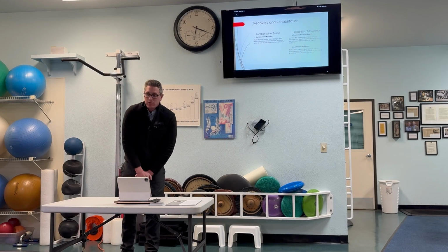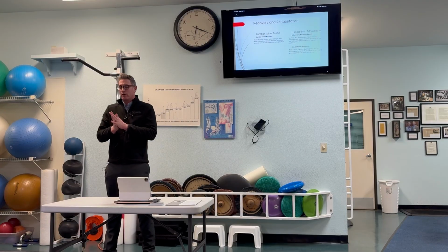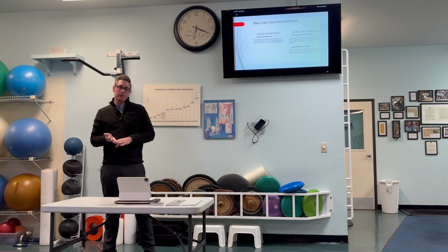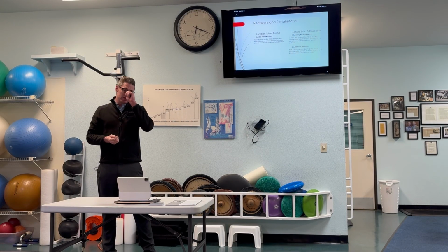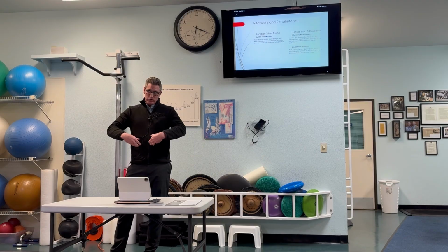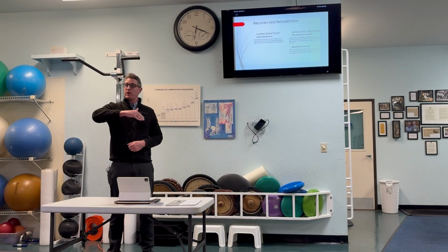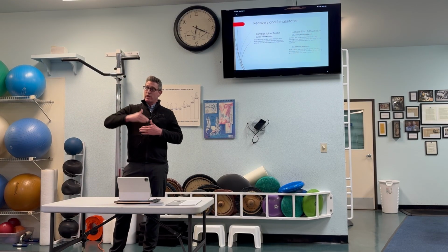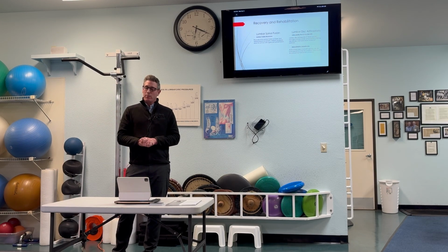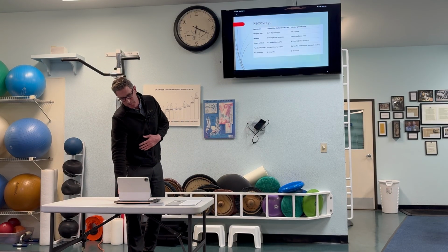With regards to recovery and rehabilitation, for the most part, I think that these are pretty similar, but as a whole, lumbar disc arthroplasty tends to be considered an easier recovery, a little bit quicker recovery, and tends to be quicker return to work. Some of that I think is because the procedures tends to just be smaller as a whole. Usually it's only done from the front. It is usually only one level, sometimes two, whereas we saw with that prior x-ray of the lumbar spinal fusion, that can be quite extensive from the front, from the side, from the back. So it's a bit of a different animal, but nonetheless, as a whole, lumbar disc arthroplasty is considered to have quicker recovery and a bit easier recovery.